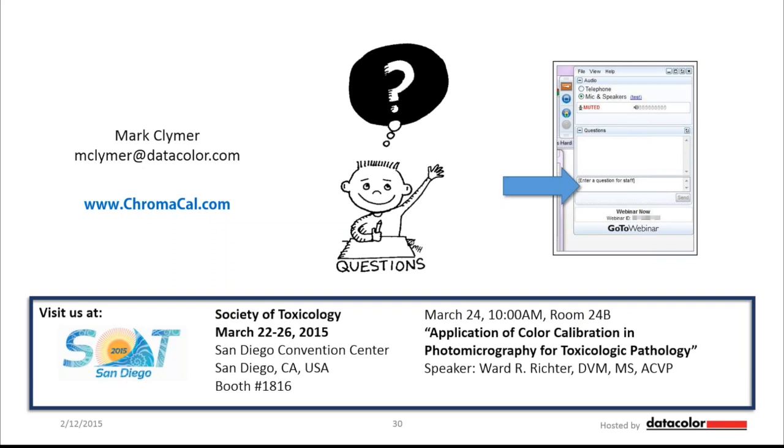Okay, another question. When calibrating some monitors, they're asked to adjust brightness, and some monitors cannot obtain a desired level of brightness. How does this affect calibration, and what do you recommend? I'll take this as well. Some older monitors aren't able to achieve what they call white point, so the brightness, and it's just the ability of your monitor does deteriorate over time. The calibration will proceed. It'll do the best it can. It'll just reset your white point, but that could be a good indication, an opportunity to, if you have the funding, request a newer monitor.